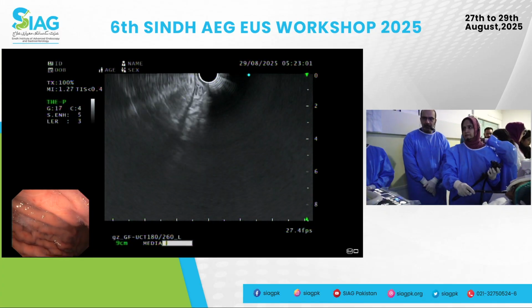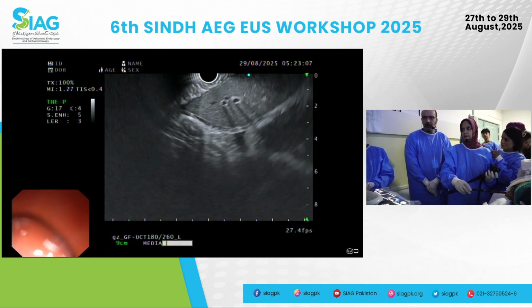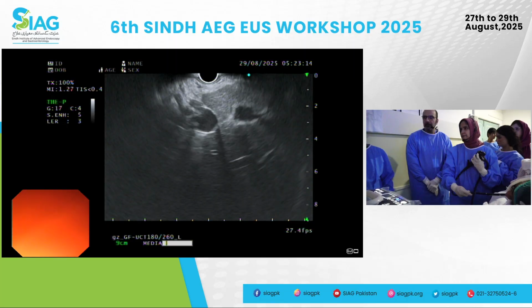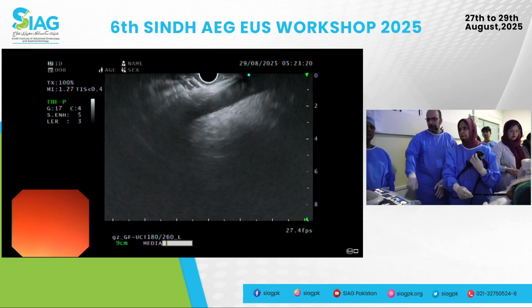Okay. Now you can go suction. Big wheel towards you, so big wheel up, and go clockwise. You can pull back a tiny bit if you want. Okay, right there. Now keep going clockwise. Good. Keep going, keep going. And there's your aorta, right?